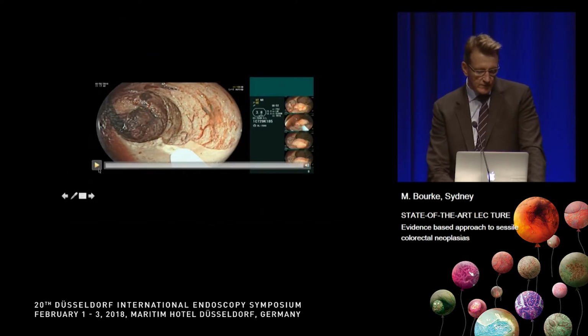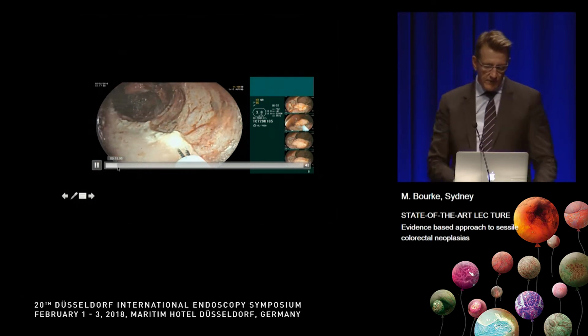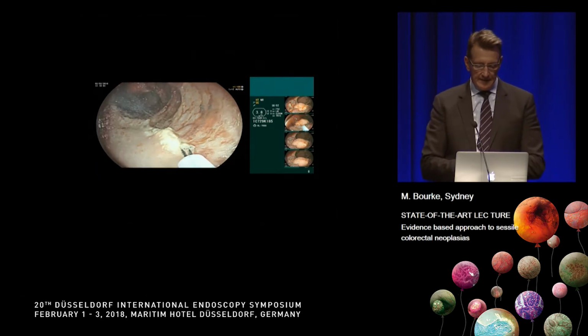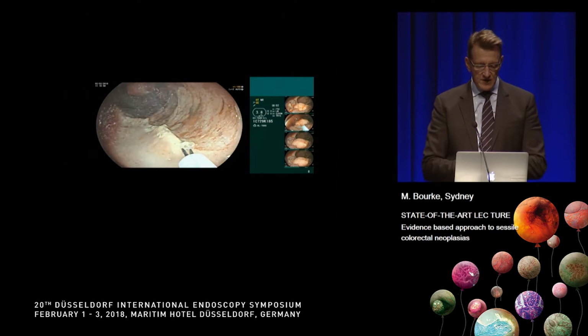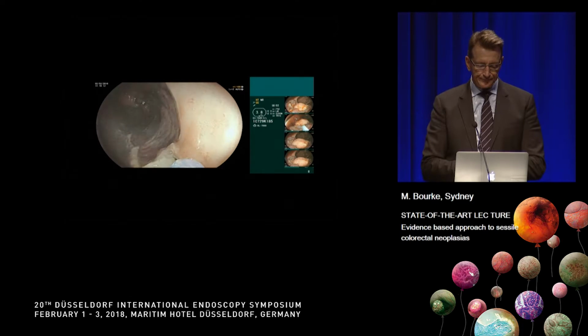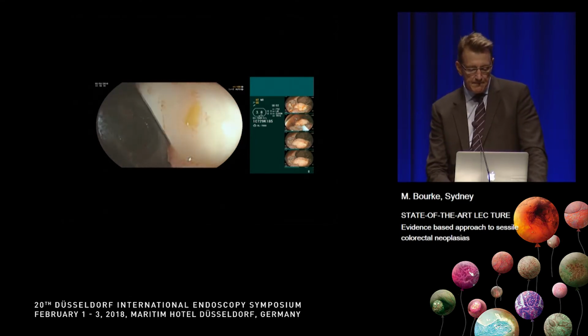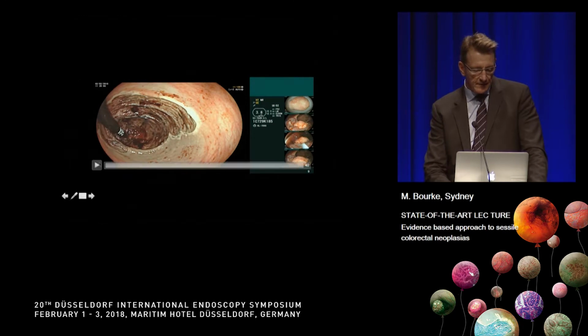And this is how it looks. This is the case from yesterday. You probably didn't get to see this, but very simply it's done like this. And you can generate a nice coagulation effect at the marginal lesion just by tracing along like so. Very simple and precise. And the end result from yesterday's case is here.